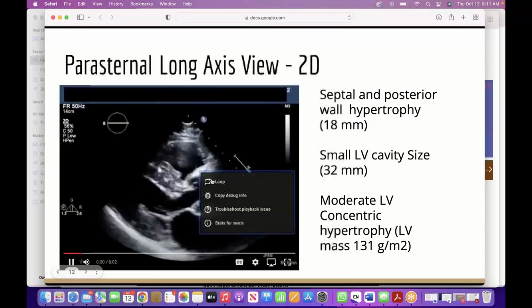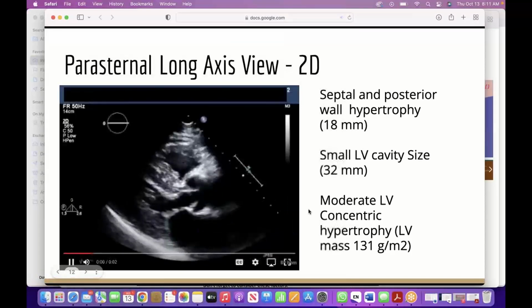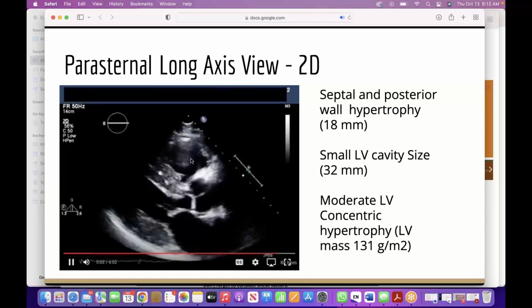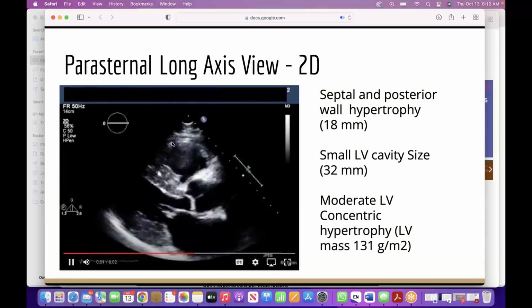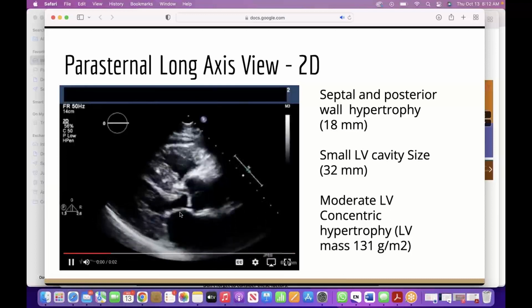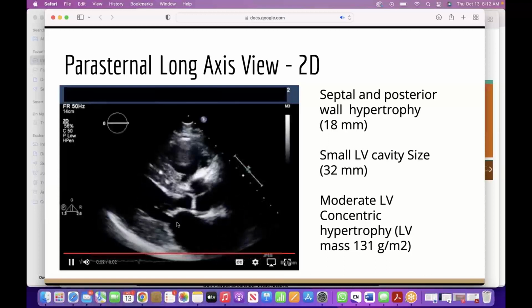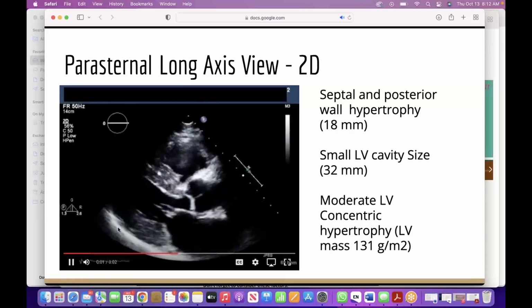So here's a parasternal long axis from this gentleman who we ordered an echo on due to his symptoms, and it essentially shows in the RVOT that there's good RV systolic function. There's no clear or large anterior pericardial effusion. The aortic valve and the mitral valve both appear somewhat thickened, but open and close well with no clear coaptation gaps. The aortic root and ascending aorta were not dilated, and there was no posterior pericardial effusion noted either.